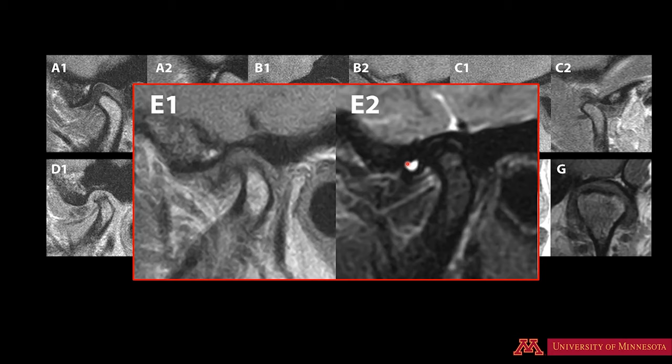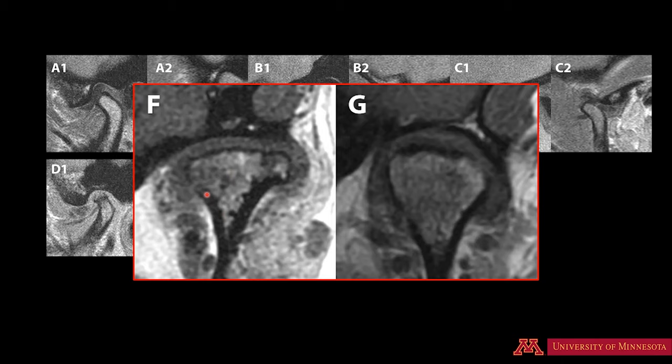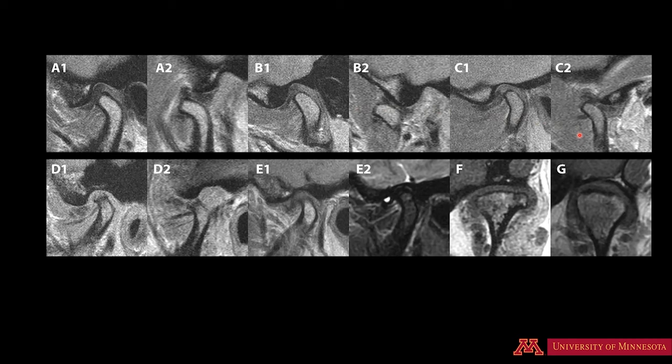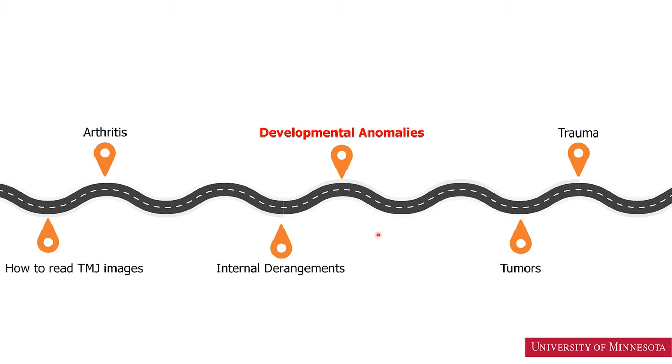All the images we have seen are sagittal slices. The following two images are coronal slices. This is the coronal view of the condylar head, articular fossa, and this charcoal gray structure is the intra-articular disc. This is the normal relationship of the condyle, fossa, and disc. On the next view, we can see that the disc is laterally displaced. These images are proton density except one, which is a T2 image used to evaluate fluid.